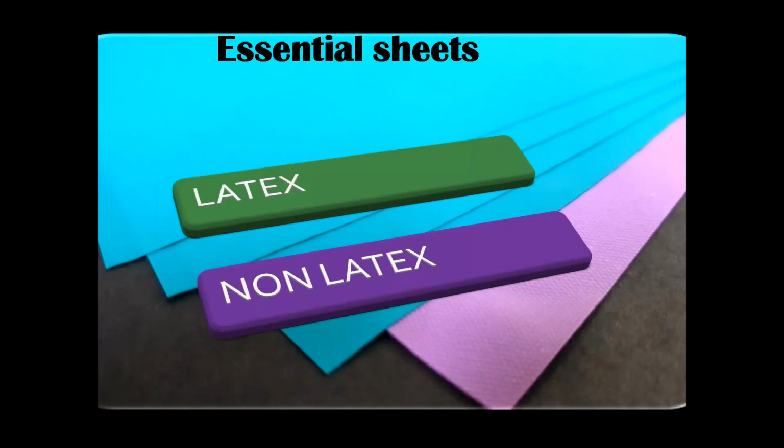And these rubber particles contain 256 proteins, out of which almost 8 to 11 are known to be allergenic. That means if there is a patient who has a history of allergy to maybe peanuts or even banana or anything, definitely he has a good chance of being sensitive to natural rubber latex. So that is the reason why every operator should have the non-latex rubber dam sheets, which are made of thermoplastic elastomers, and they do not contain natural rubber latex. The thermoplastic elastomers are very good in their flexibility, in their elongation and tear resistance, and their properties are at par in some cases. So that's why it's important for the operator to have one latex and one non-latex set of sheets.